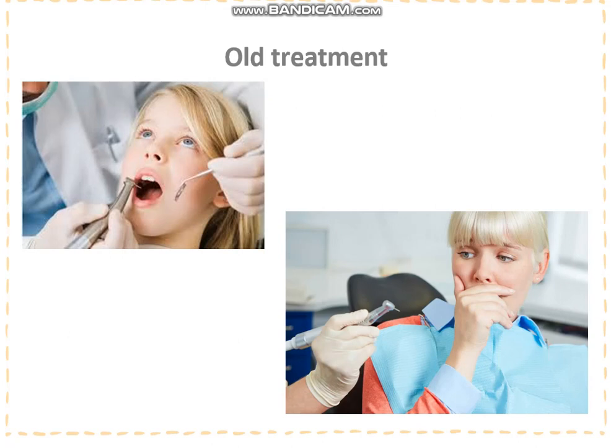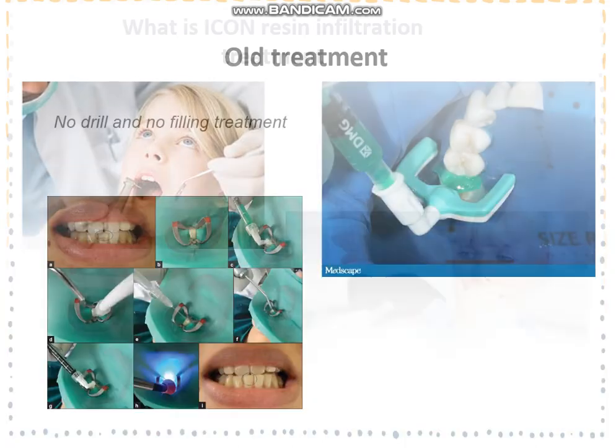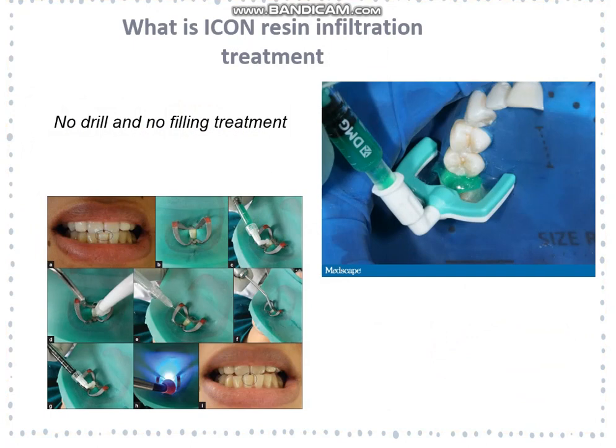And in case the cavity is small and at the proximal surface, the dentist will drill healthy enamel structure to get access to this cavity. Also, we should mention that drilling is very dangerous. In order to replace the drilling technique, resin infiltration is applied.